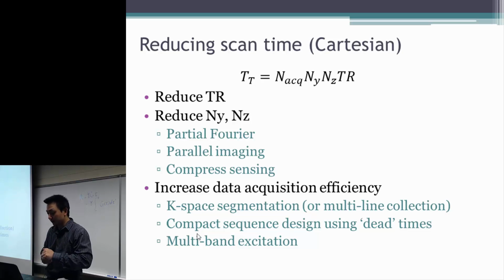There are also several methods associated with this one. As I mentioned last time, in industry we usually call this acceleration in data acquisition, and we use a turbo factor to represent it.